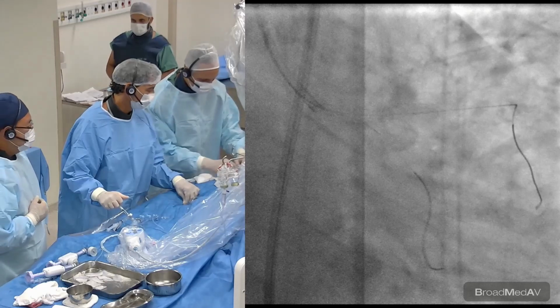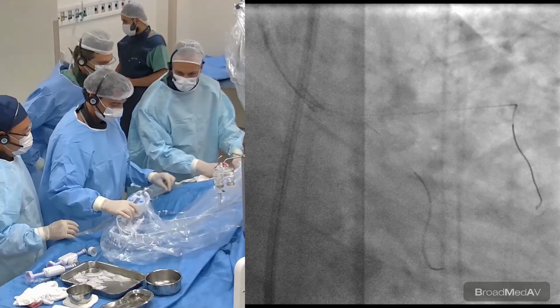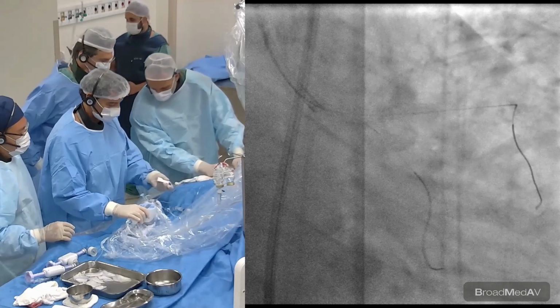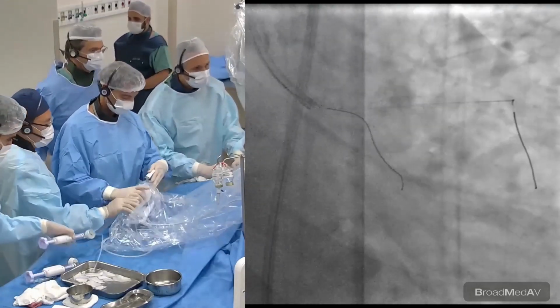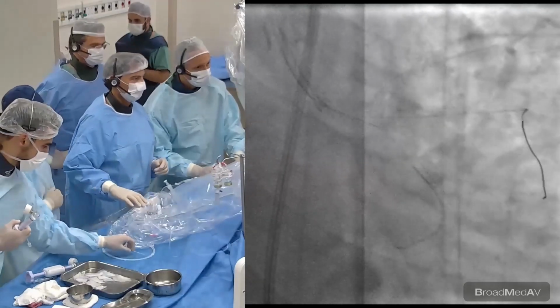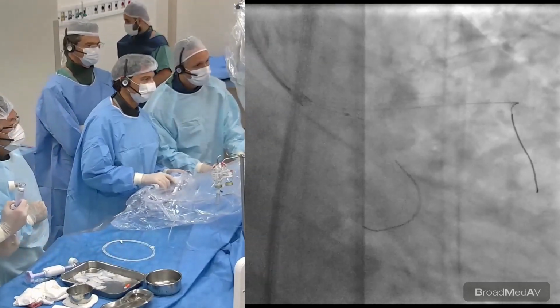We have not seen that POT in terms of clinical benefits. Even though theoretically it's a good thing, when I do 2 stents, I always would do that. I think we should extra optimize the carina, but here I feel comfortable the way we are. Watch the wire in the circ. Yeah, we're just advancing here a little bit. Be careful with the wire. Yeah, it's in another branch there.